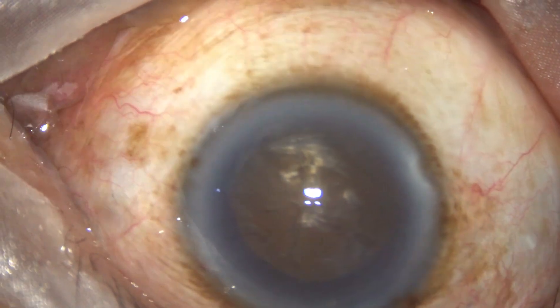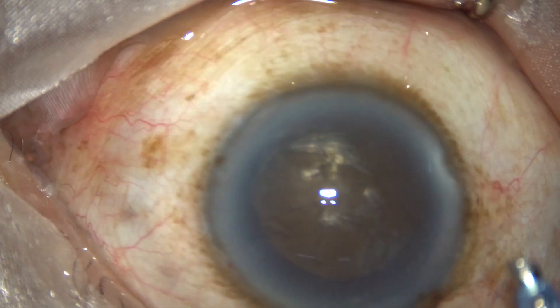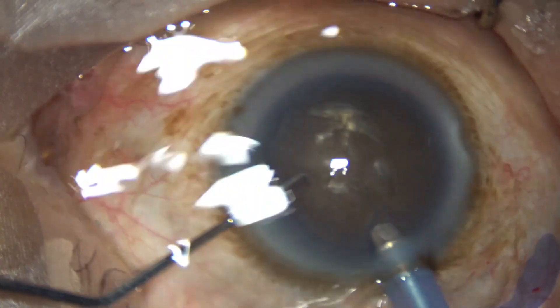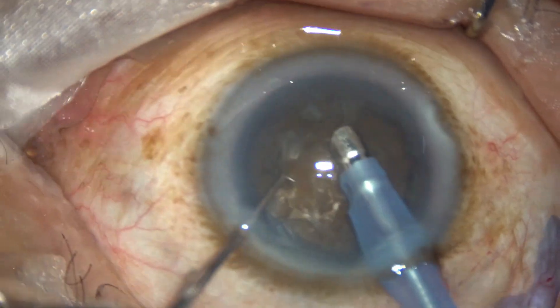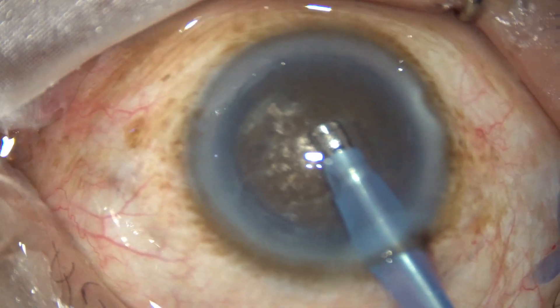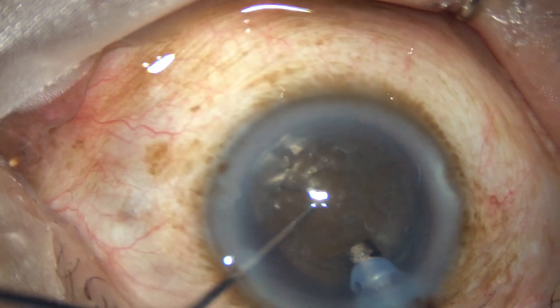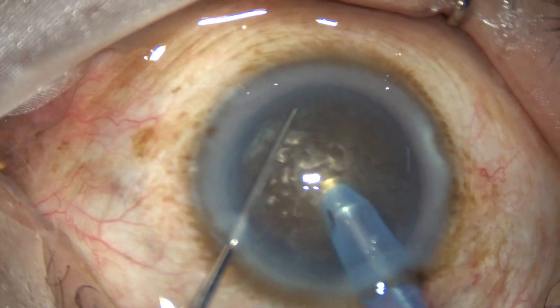The exposed part of the phaco needle has to be examined — it should be this much. In soft cataracts the exposed part is much less. This technique is known as the submarine technique. First, some superficial cortical lens matter is removed, and then the handpiece is turned to make the bevel up. Now the phaco needle is buried into the substance of the nucleus just in front of the main incision, and it travels through the substance — as a submarine moves through water under the surface.